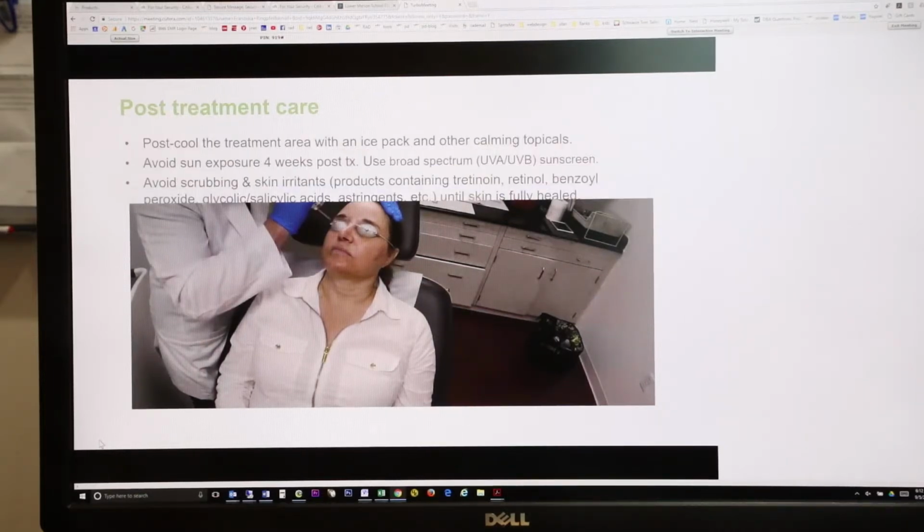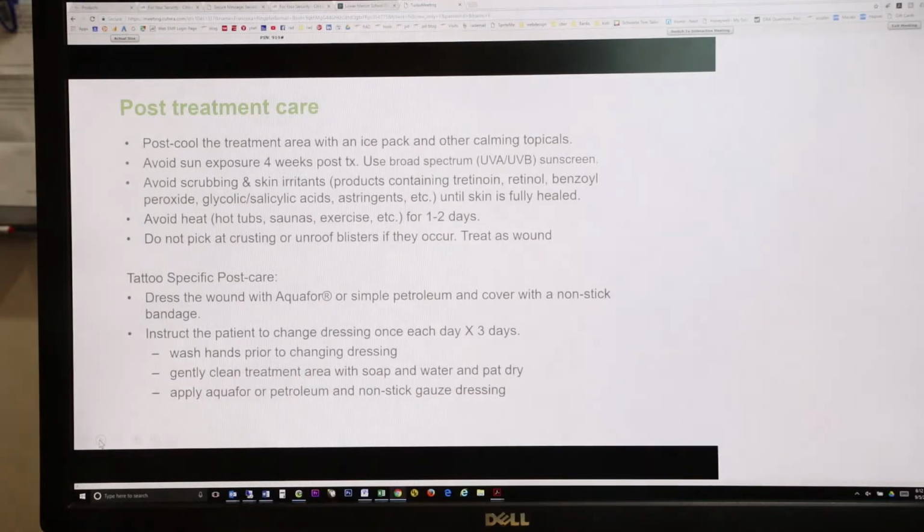So, post-treatment, again, this isn't a device that deposits heat, unlike our other laser devices. However, the patient can generate their own heat. So if they're telling you they feel hot, then please advise some aloe vera, hydrocortisone if it looks angry, a steroid, and a gel ice pack. Avoid the sun 4 weeks before and after. They can't cause any hemosiderin from the injury, and they can't be any tanner when they come in for their second treatment or their repeated treatment.